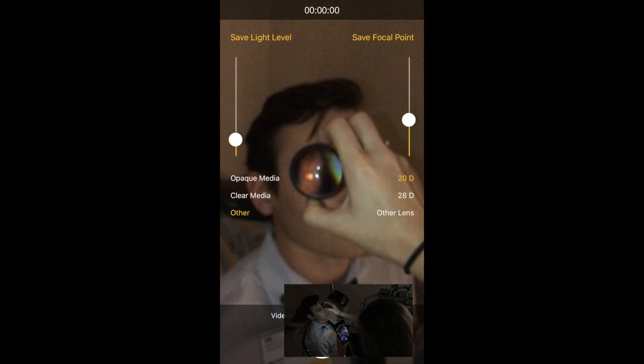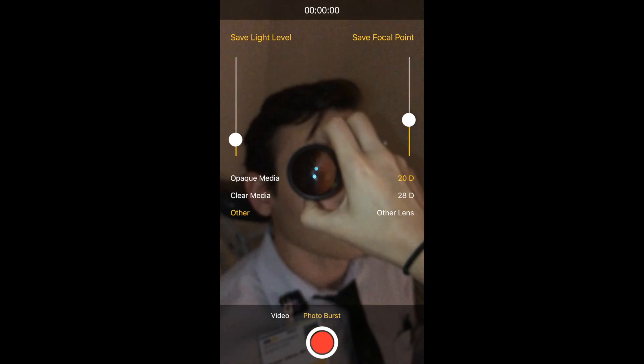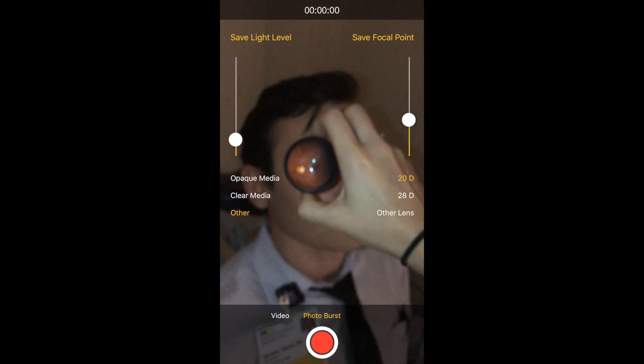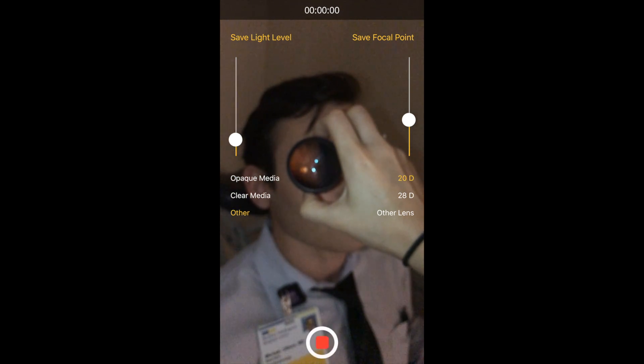Once you feel like you're getting a decent view, you want to push the record button for both the video and photo burst mode.